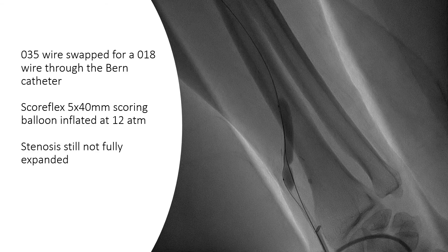We decided to try a scoring balloon. We swapped the 0.035" wire for an 0.018" wire to the Berenstein catheter, then deployed a ScorFlex 5 mm scoring balloon at 12 atmospheres.